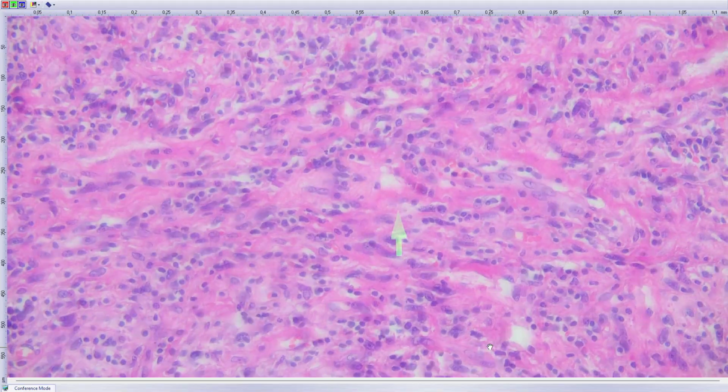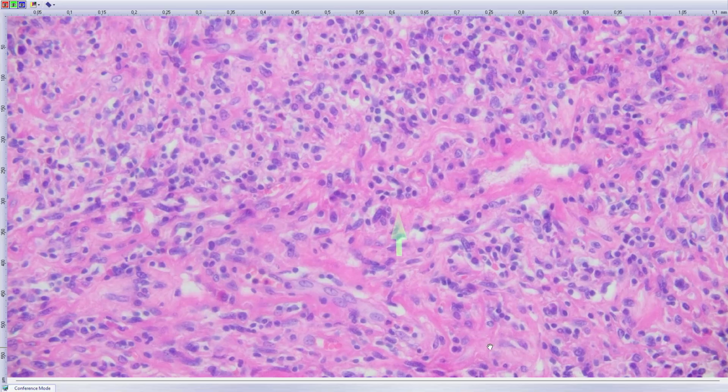Yeah, so cells like these. So I did stain MDM2, and there was some expression actually, but definitely not enough to call this dedifferentiated liposarcoma. To make sure, I also did MDM2 FISH, and it was negative. So it's not a dedifferentiated liposarcoma.